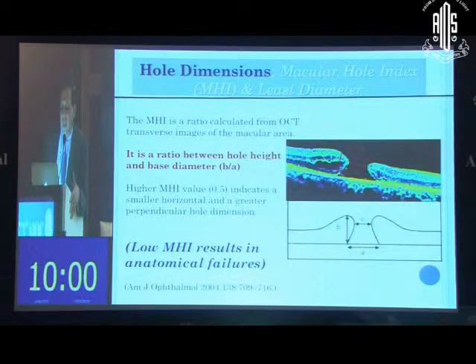These bands tell you about the visual outcomes, how they are. You do get to see the bands become continuous from discontinuous bands. So the study of the OCT is extremely important in macular holes, or for that matter, as Dr. Mallika showed very nicely, OCT plays a major role for all macular pathologies.